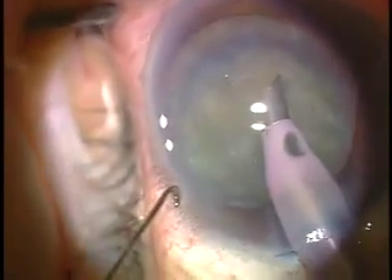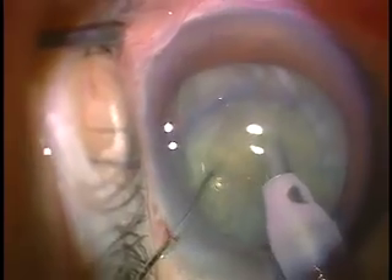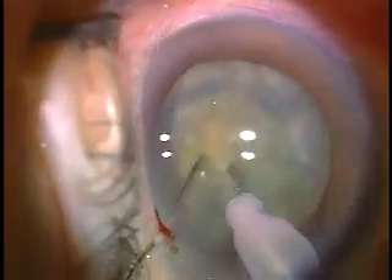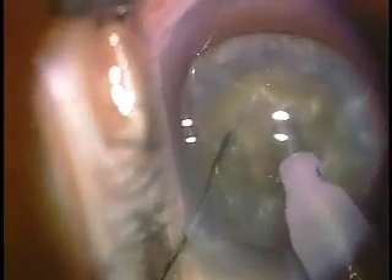This is a Hefliger cleaver, which is my preferred chopper. In a very dense lens it could be longer at the tip for more complete fracturing, but this works and is my preferred configuration for the average nucleus.